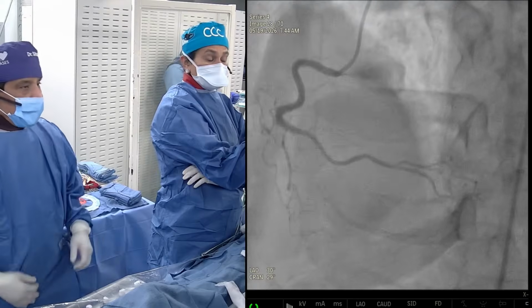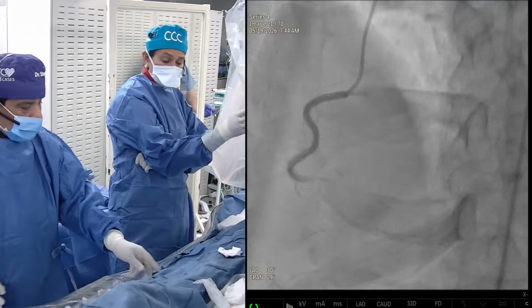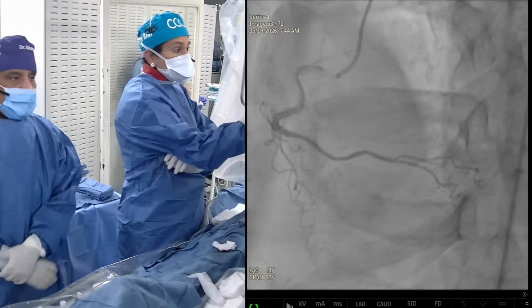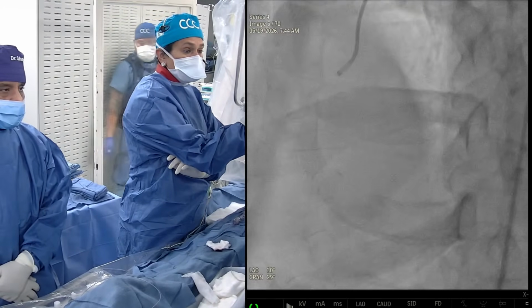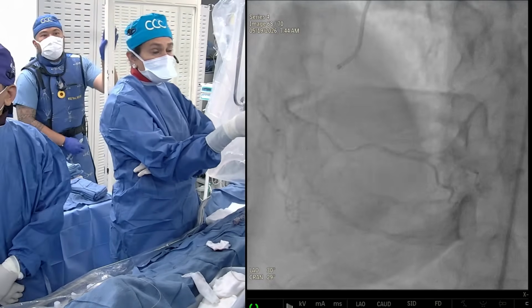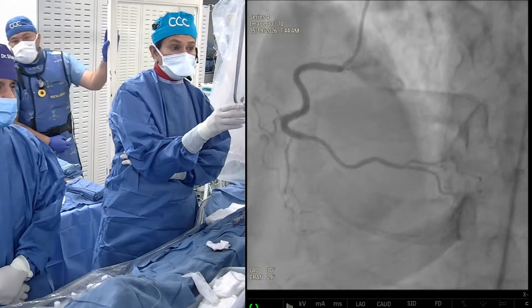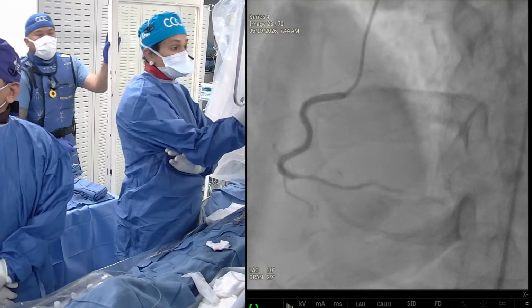So this is a little different, but a similar experience, and there are educational points. On the right corner, you can see the EDP was normal, EF is normal, and the right coronary artery had a significant lesion which has been taken care of. And you can see the tram track calcium of the left side right now. Look at the calcium.